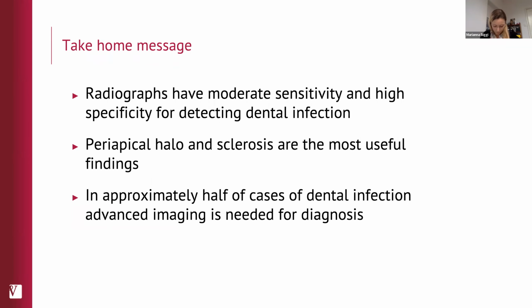So I think I'm going to conclude, and then we can get on with some questions. Of course, this is not an exhaustive talk of everything you can possibly see in the teeth, but some ideas on how you can get on to interpret radiographs.